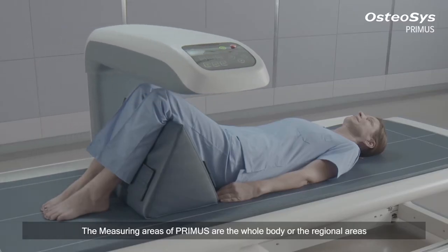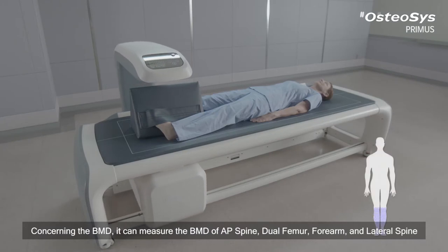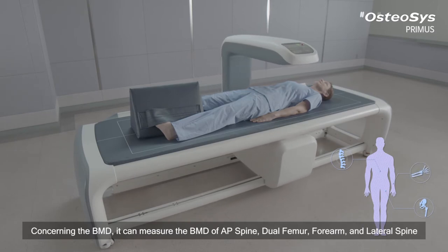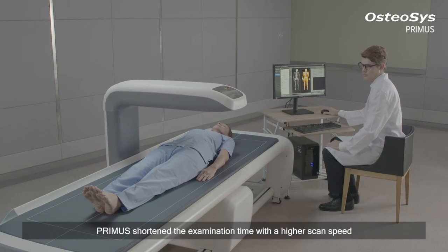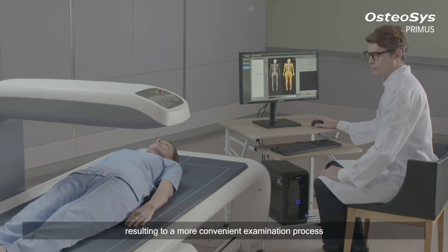The measuring areas of Primus include the whole body or regional areas. For BMD, it can measure the AP spine, dual femur, forearm, and lateral spine. Along with its widened scan area, Primus shortens examination time with a higher scan speed, resulting in a more convenient examination process.